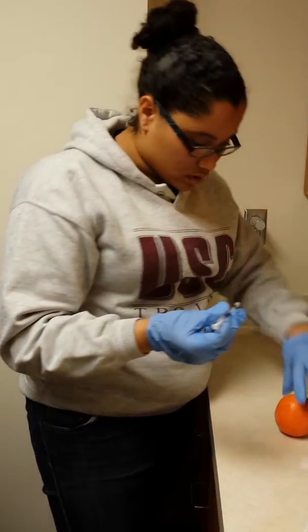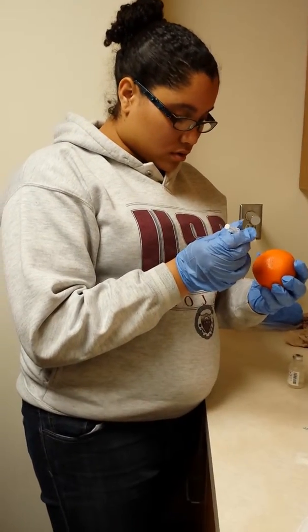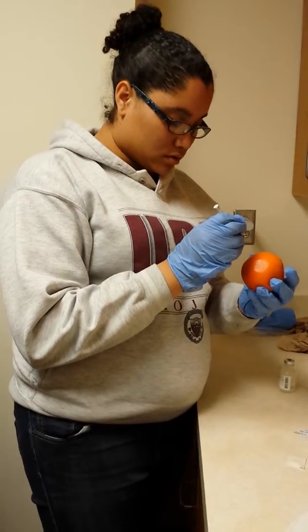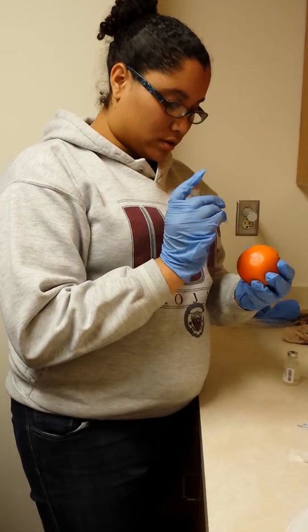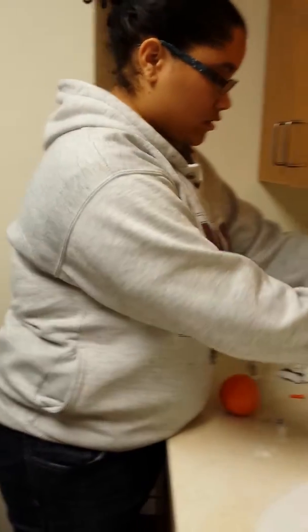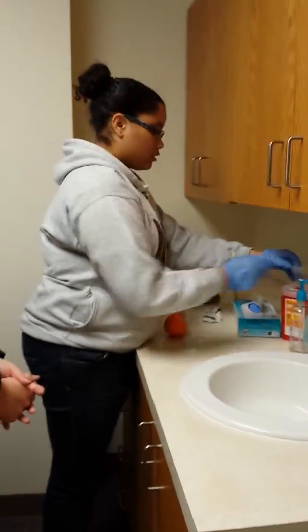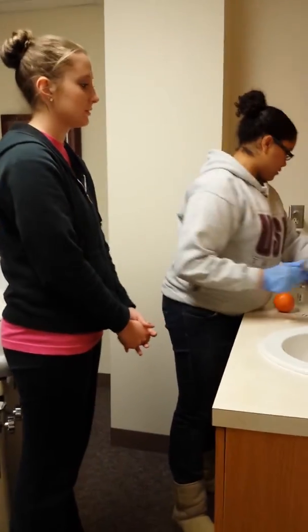And then so I just stick it in straight? Yes, or you can do it at a 45-degree angle. Hold it like a pencil and stick it in. Then push it down and pull it out. And then you put your needle in your sharps container. And never put the top back on it? No, because it increases your chances of sticking yourself.